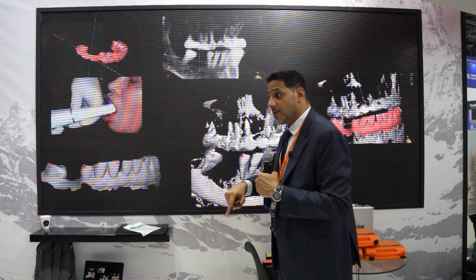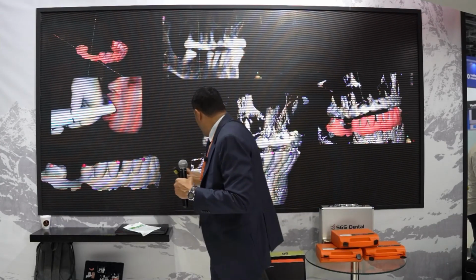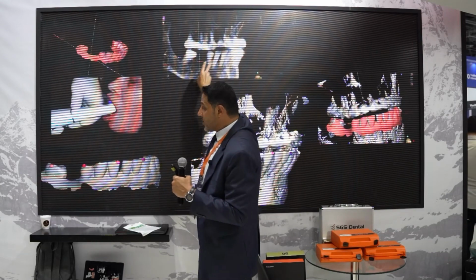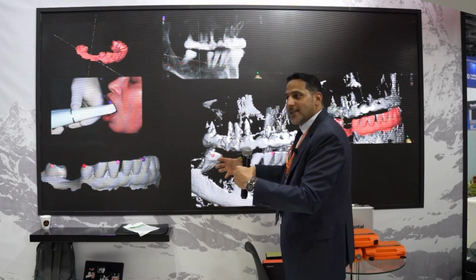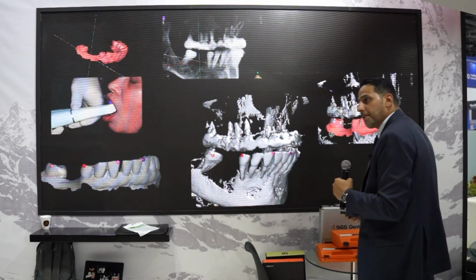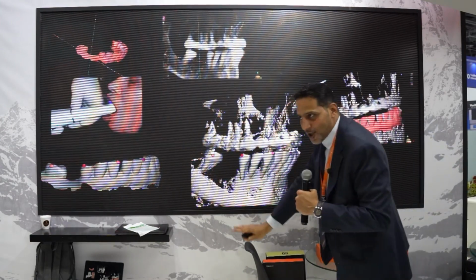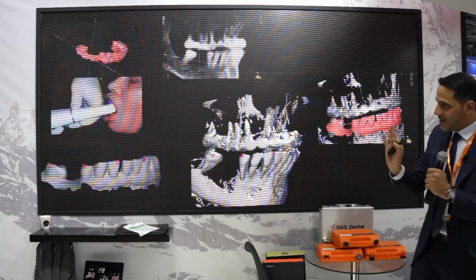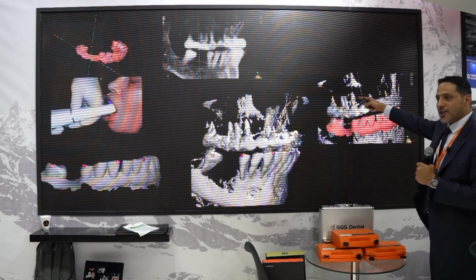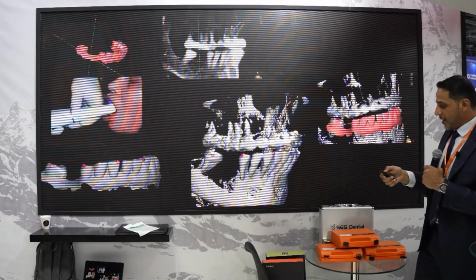After the CBCT, because you have this in the software. So put any reference, cusp, like 5, 6 dots, so the computer will realize and will merge it together. Even for edentulous patients? Totally different game. We're talking about a partially edentulous patient. In the completely edentulous, the game is different.